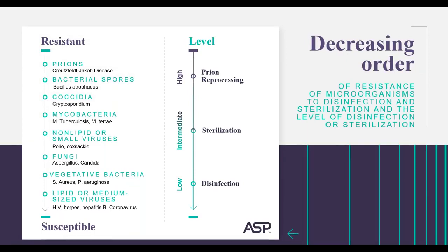So I don't know if you're familiar with William Rutala, but William Rutala is a national, if not world-renowned, epidemiologist out of North Carolina. And he and Weber wrote a book, Sterilization and Disinfection, in 2008, and it's still on the CDC website. It since has been updated to 2013, but it's still available to anyone who goes to the site.